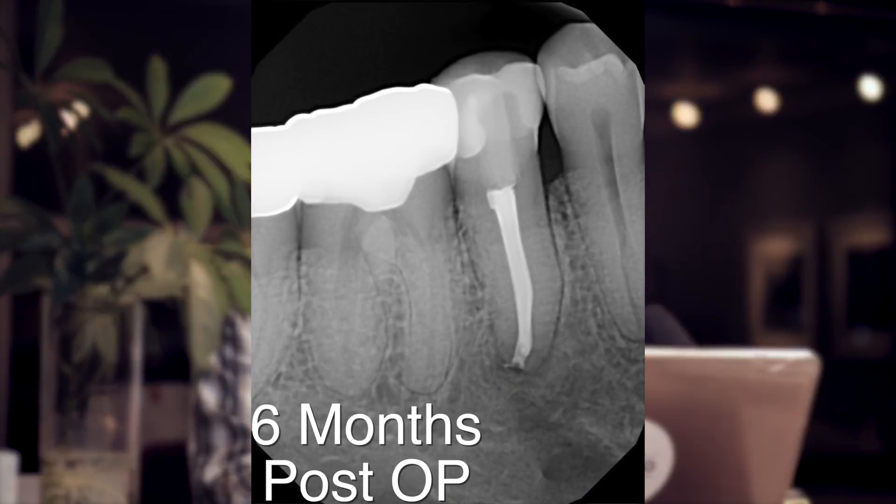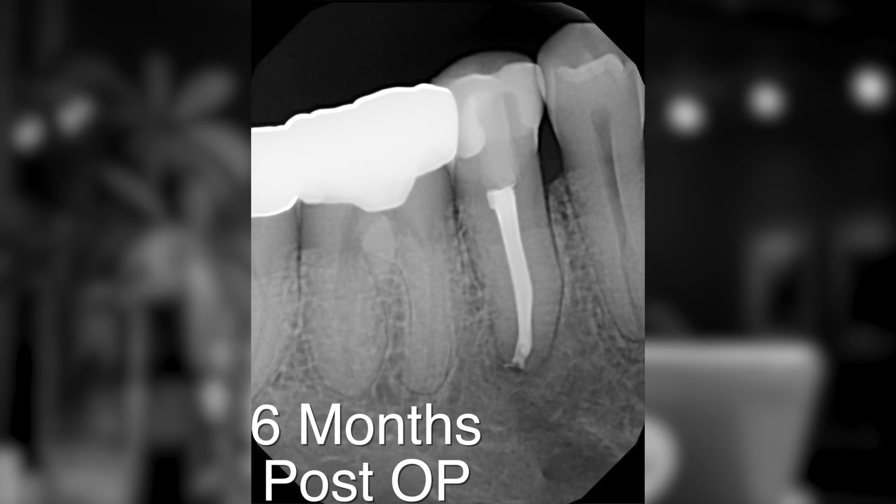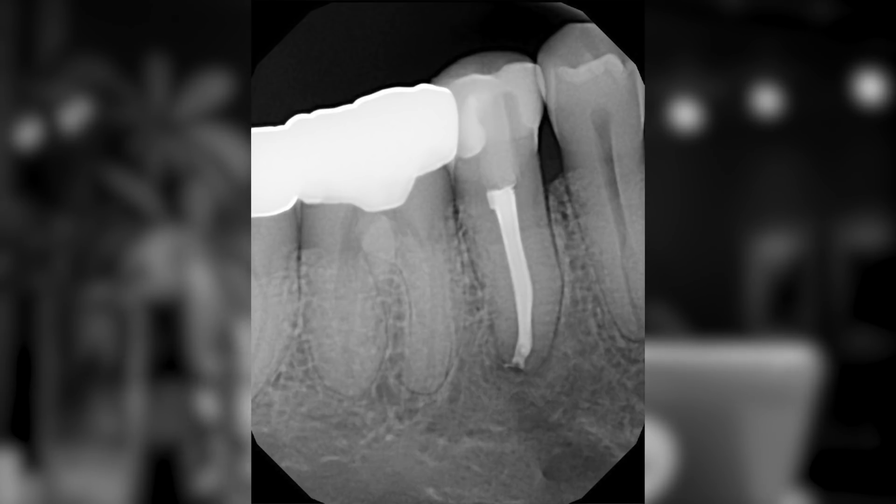The follow-up radiograph today, six months later, shows significant healing in an asymptomatic tooth. I will follow up with this patient and share the full healing of the case with you.